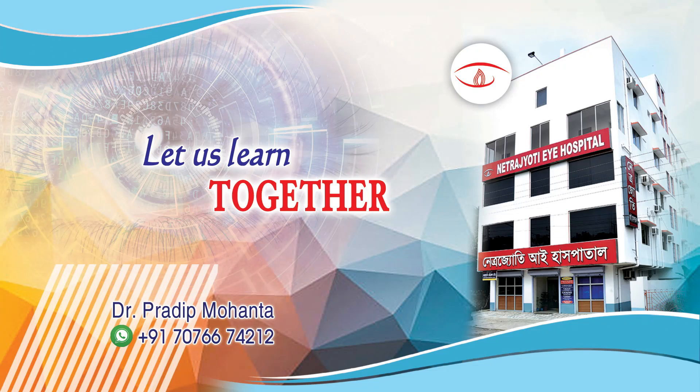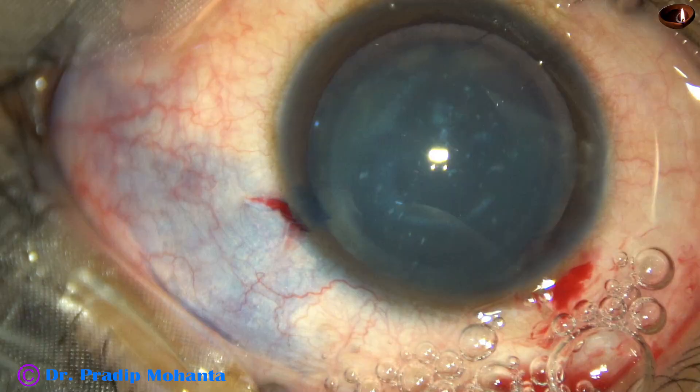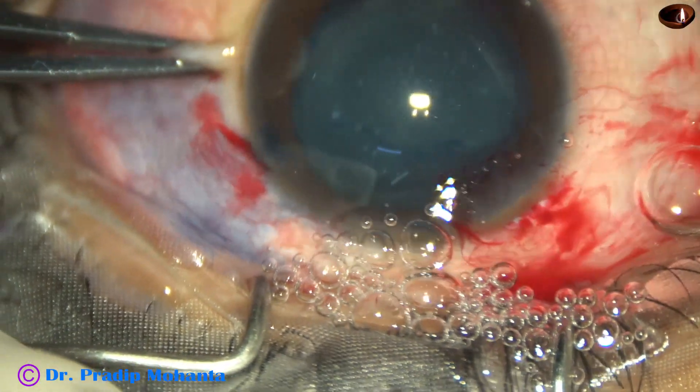Friends, welcome to my workplace at Ranakh Heart, West Bengal, India. This is a developmental cataract in a 12-year-old boy. Let us observe this surgery.